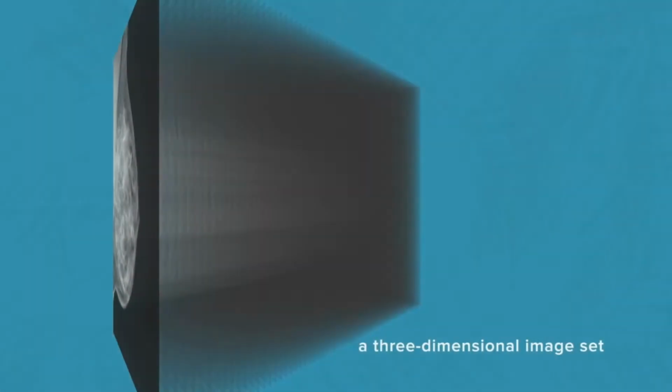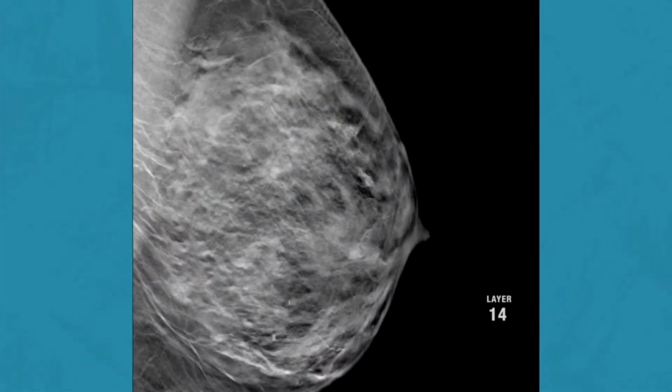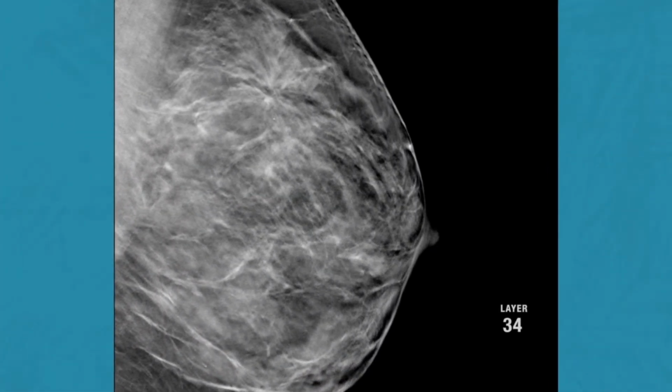Conventionally speaking, a 2D mammogram is done like a flat sheet of paper, so you have this phenomenon called superimposition. Because you're looking at a flat image, the anatomy superimposes upon itself and can create the impression of a mass, or worse yet, obscure the presence of a mass. With a 3D mammogram or tomosynthesis, we can scan progressively through the breast and rid ourselves of that superimposition phenomenon, and see things in greater detail and see them essentially in 3 dimensions.